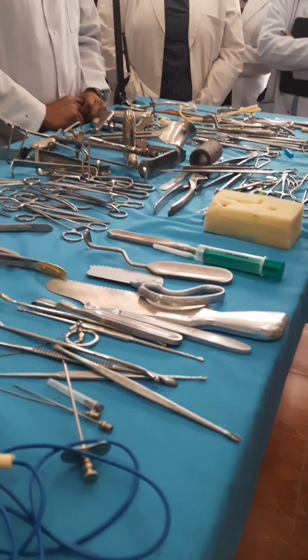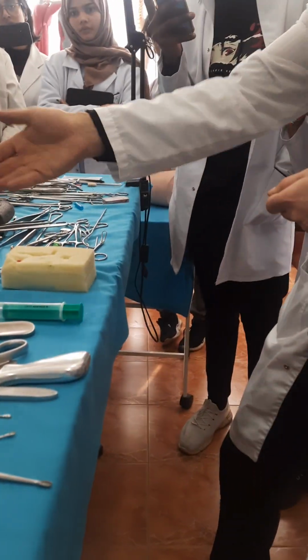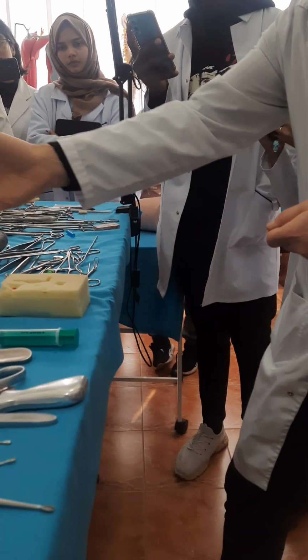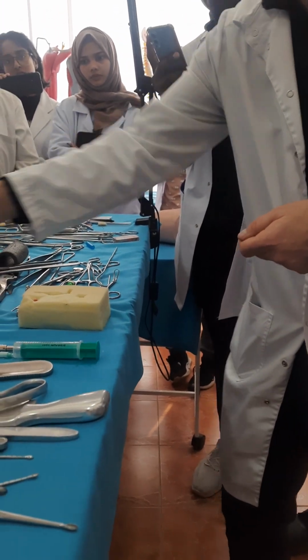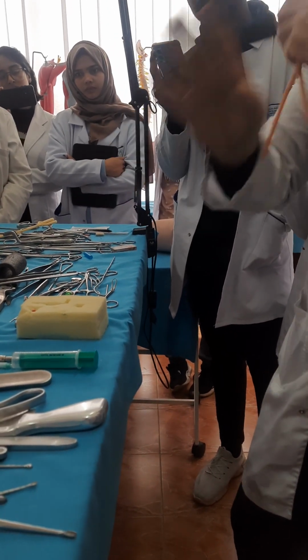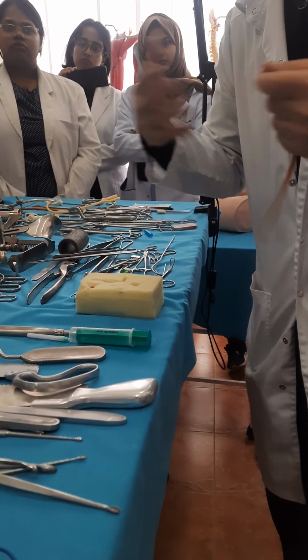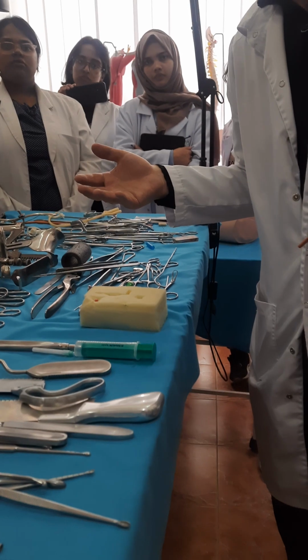And the permanent method outside of the wound: you open, take the ligature needle, I say I don't have it, but it is also included inside of this group, and you ligate the artery outside of the wound, and forever. Believe me, if you apply a ligature on the vessel, this vessel cannot be opened after. You destroy the wall of the vessel.